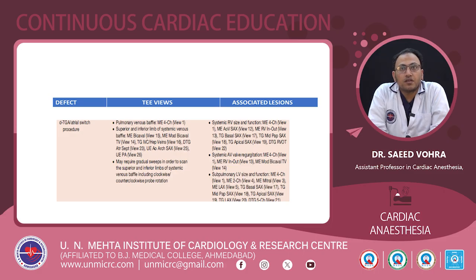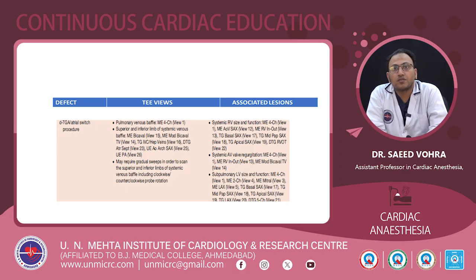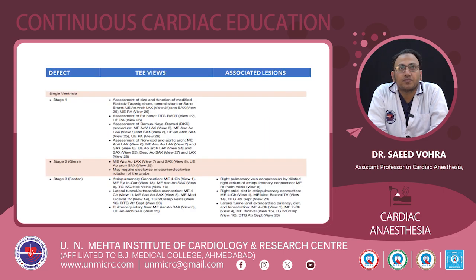For systemic RV size and function, the mid-esophageal 4-chamber view, aortic valve short axis view and RV inflow view will be useful. For systemic AV valve regurgitation, the mid-esophageal 4-chamber view, RV inflow view and modified bicaval view will be helpful. For seeing whether there is subpulmonary LV size and function, the mid-esophageal 4-chamber view and 2-chamber view will give you the information.